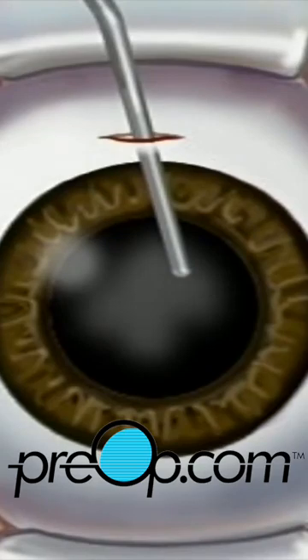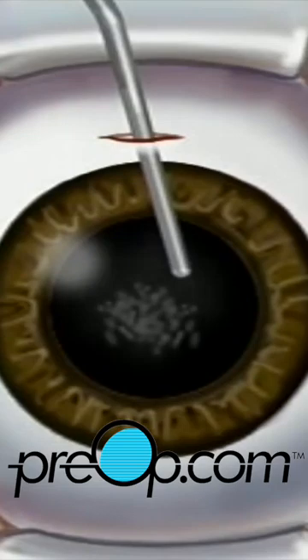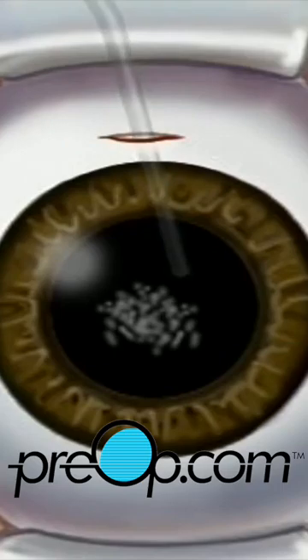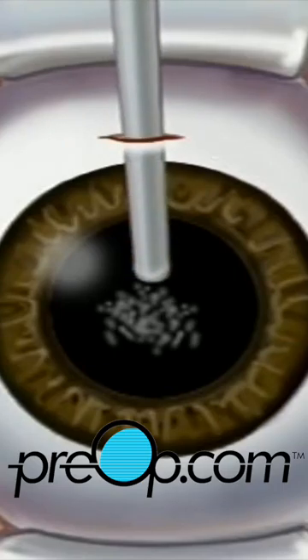Most likely your doctor will use a small probe which vibrates at a high frequency. The probe vibrations break the old lens into microscopic pieces, which can then be drawn out with gentle suction.